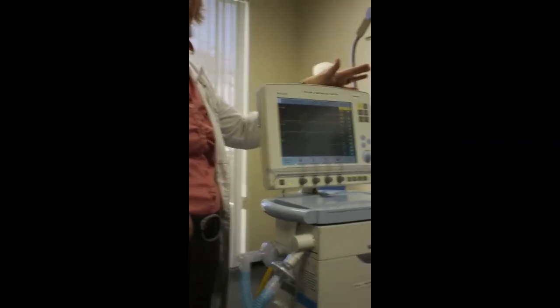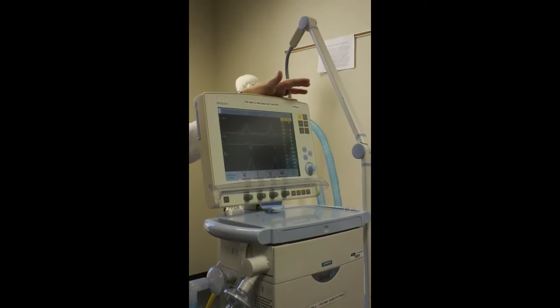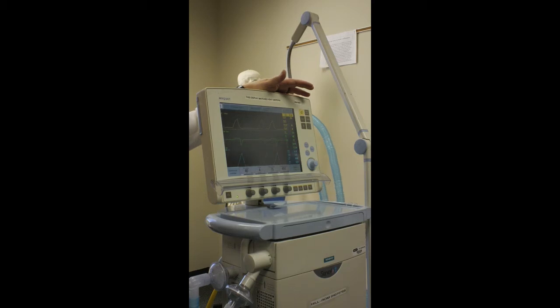Because remember, you're doing a breath hold on your patient when you do that. You don't want to do it for a long time, it'll be very uncomfortable for them. Make sense? Okay, yes. Is the compliance one the same as the static pressure? Static compliance is not necessarily static pressure, but we measure static compliance, which is what that plateau is for, because you have no airflow. Okay.